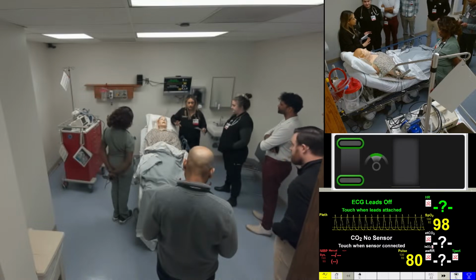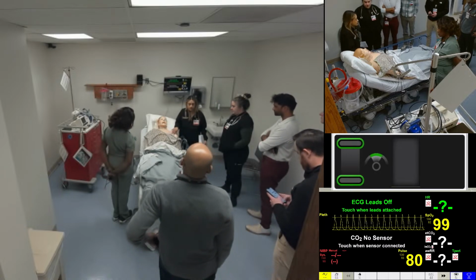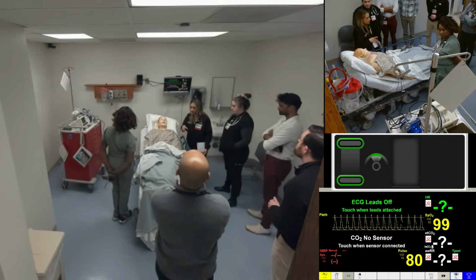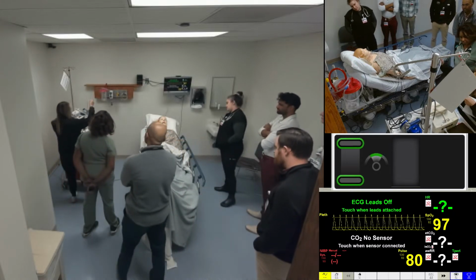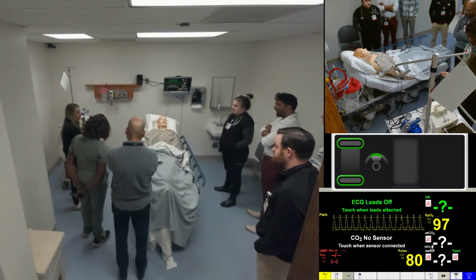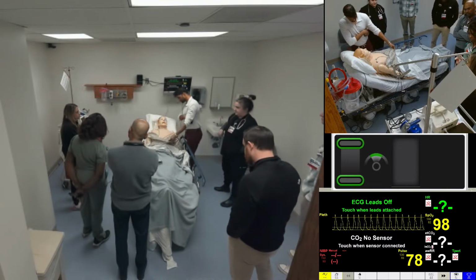Remember, I'll read you the scenario right now because everyone starts with the same scenario, but there's different things that happen, right? He is going to be attached to Telly for our purposes today. Remember over here that your crash cart, you should know what's in your crash cart by now, and use it appropriately. Remember that these little white guys are our pads, right? So when you're thinking about shocking our patient, if you need to shock, you have to attach these friends.